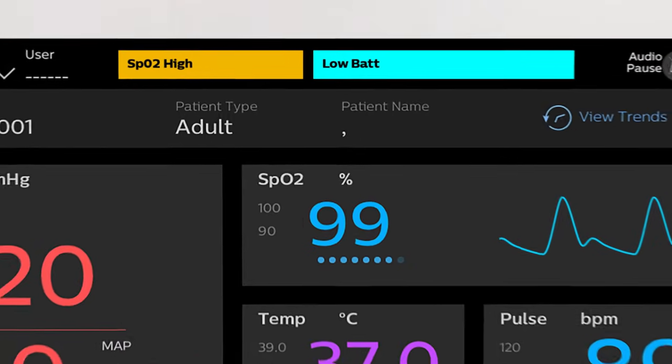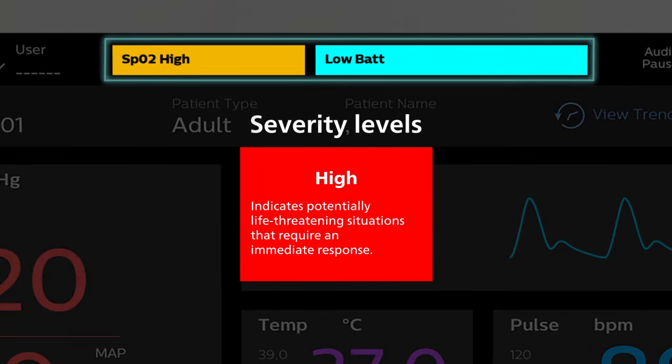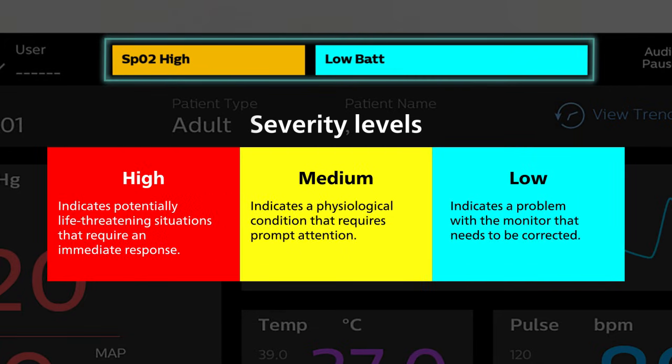The VS30 provides both visual and audible alarm indicators that vary based on the priority of the alarm. Red alarms indicate a potentially life-threatening situation that requires an immediate response. Yellow alarms indicate a physiological condition that requires prompt attention, such as an alarm limit violation. Blue alarms, or in-ops, typically indicate a problem with the monitor that must be corrected.